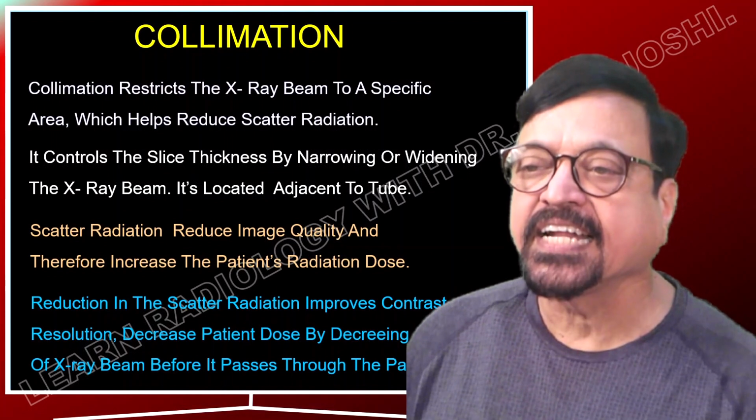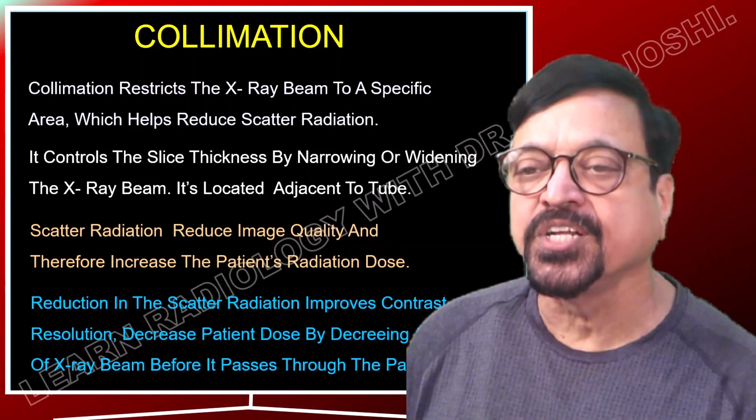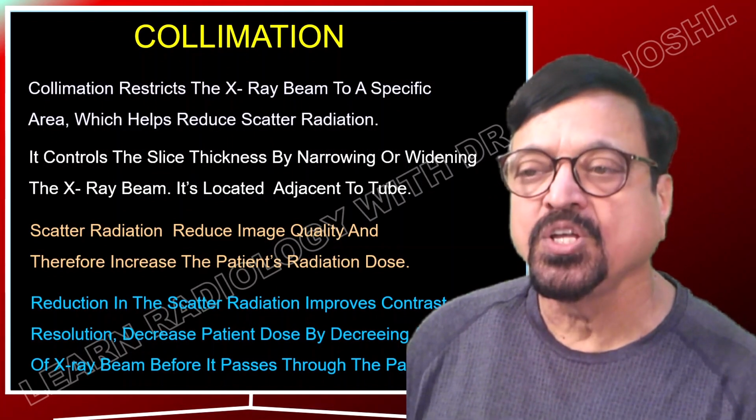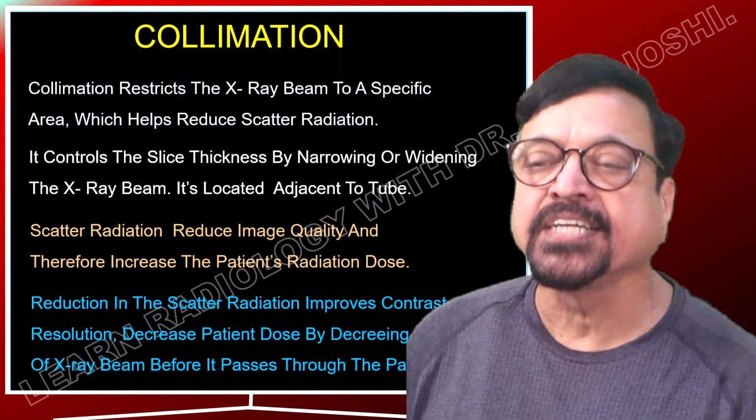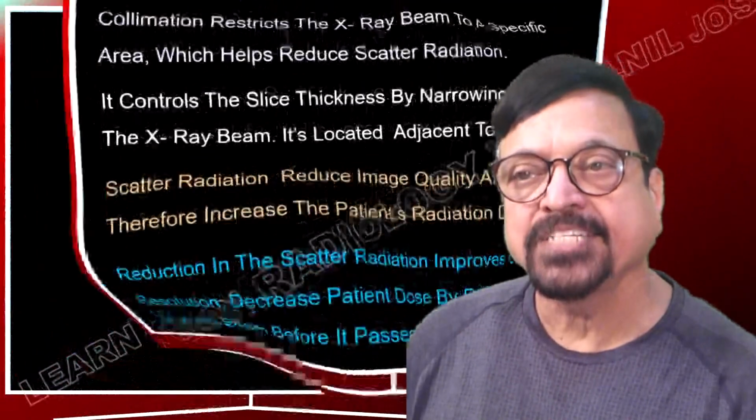Now reduction in scattered radiation improves contrast resolution and decreases patient dose by decreasing the amount of X-ray beam before it passes through the patient.